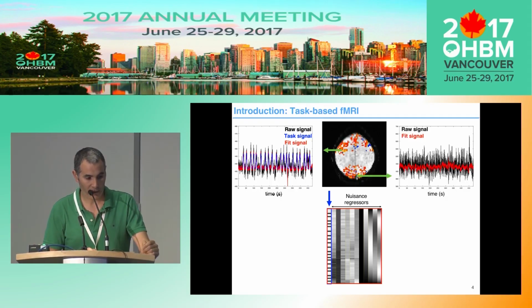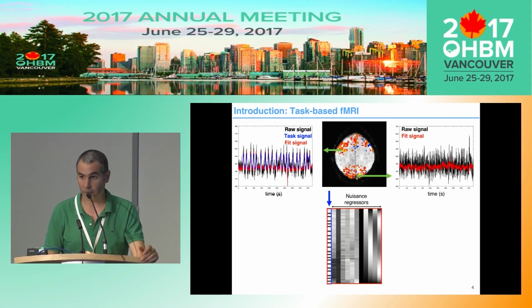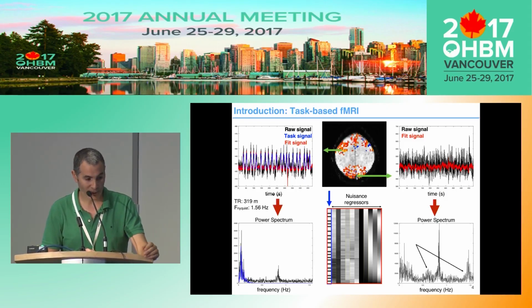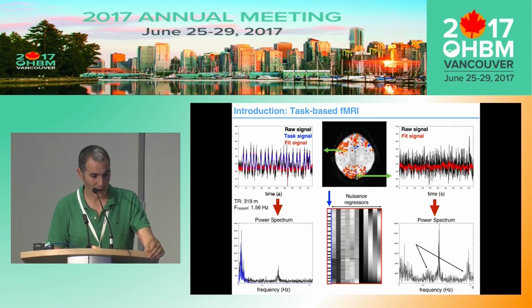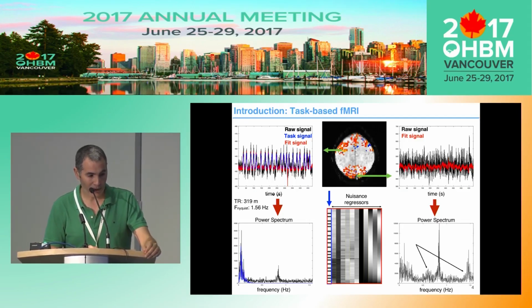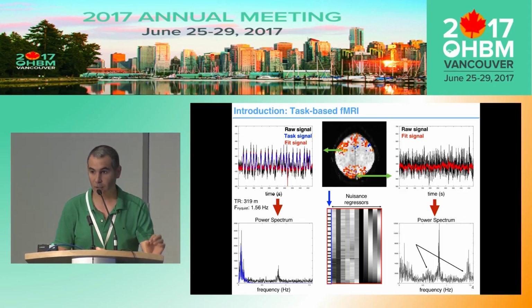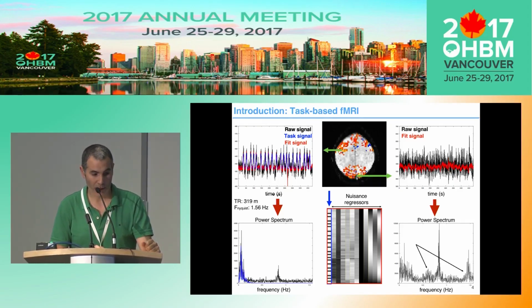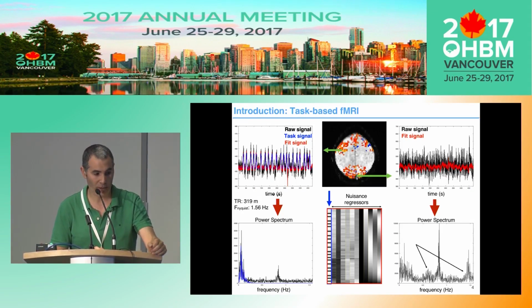It turns out that we see the time series in the time domain, but if our sampling rate is really fast, like in this case, where we have about 300 milliseconds, we can see that the frequency response of the task-related component only occupies the low frequencies of the spectrum. But we also see some peaks. What are they? Those are components in the signal that are present there, but are hidden in the response.